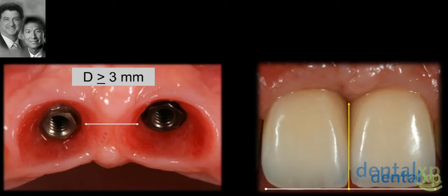So what you're looking at is a fake papilla. It's a pseudo papilla, a papillary illusion, as David and I sometimes call it. It's not really a papilla because it's short. All you've done is increase the contact area and made it longer so that there's no black triangle. But look at where the papilla height is. It's insufficient. It's adequate for 2 centrals. We sometimes get away with it, but it's not perfect.